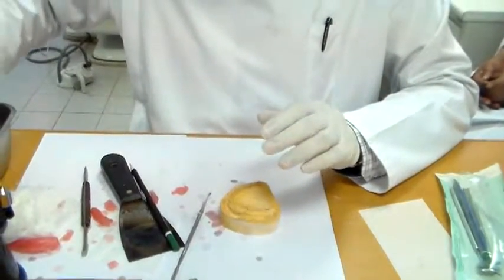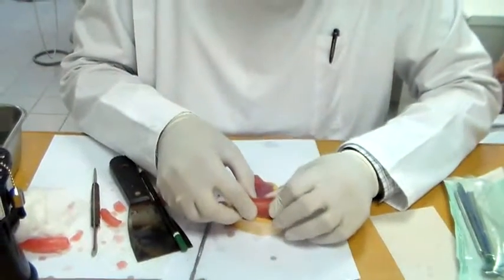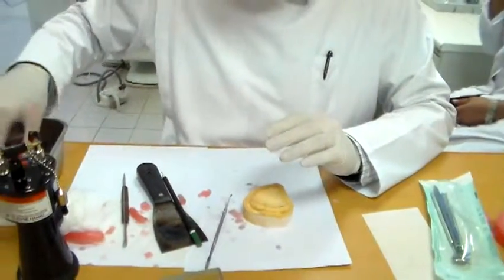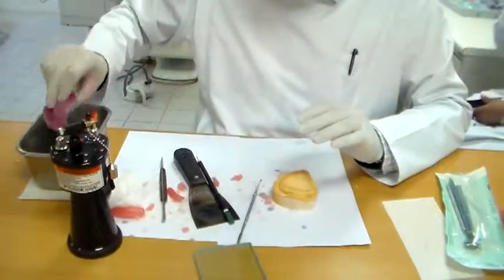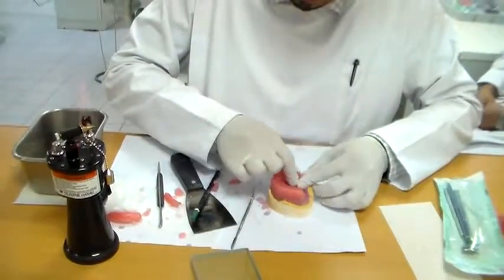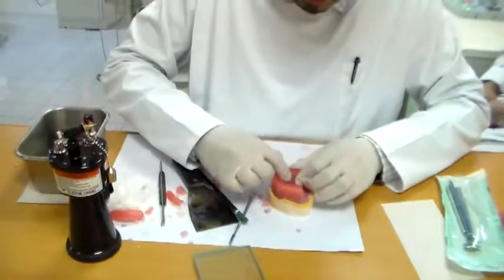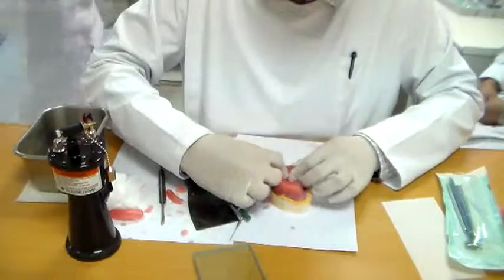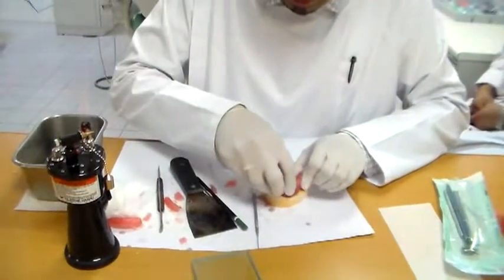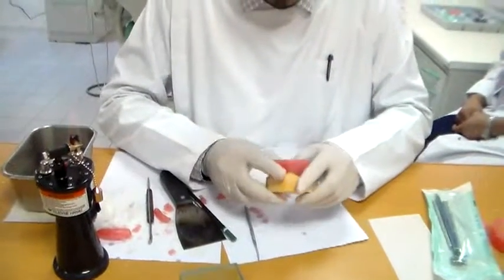And then warm water. See how it is flexible. Warm water. Everything behind the canine is a straight line. From the canine, it starts to curve up to form the anterior segments.